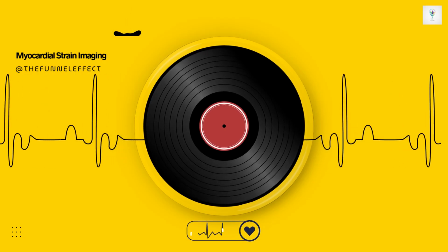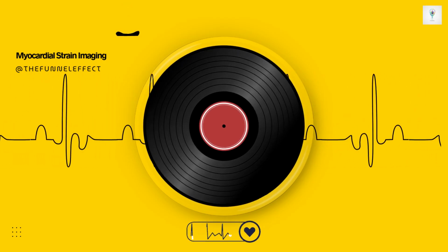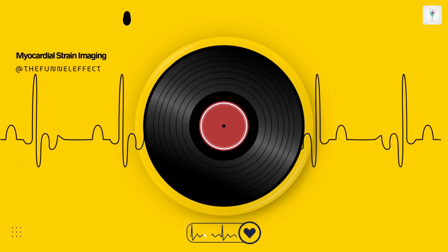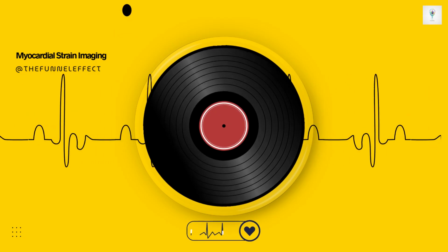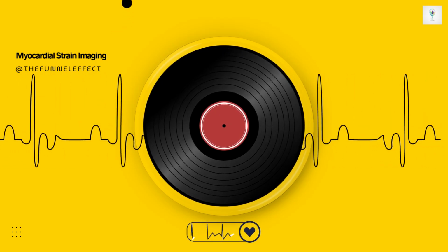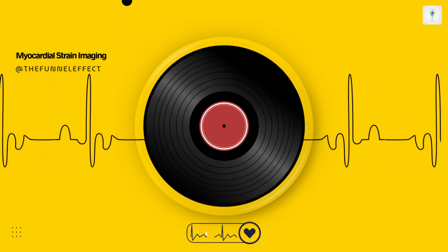We also have to deal with standard echo issues, image quality limitations, artifacts like shadowing or dropouts, out-of-plane motion, and the big one we mentioned earlier, vendor dependency. Right, the different machines giving different numbers.